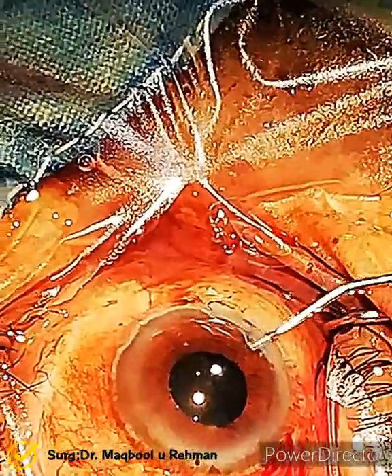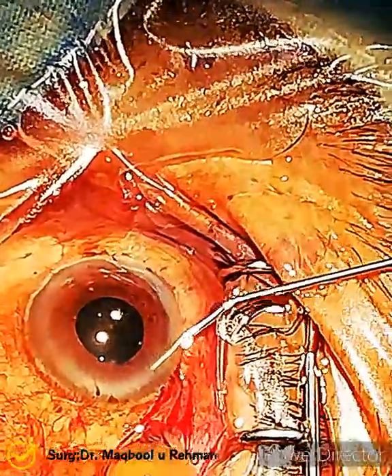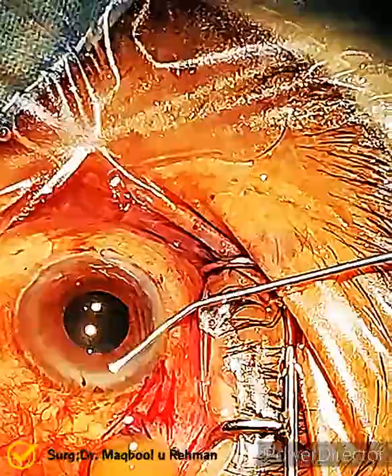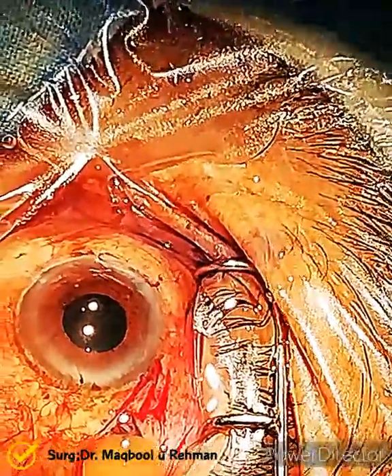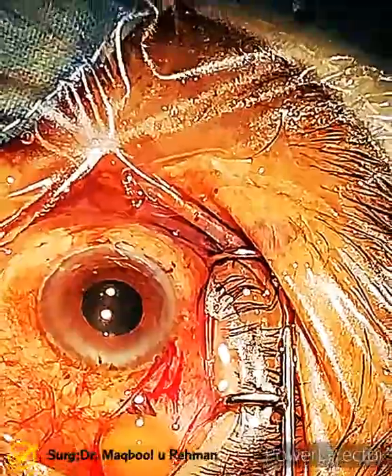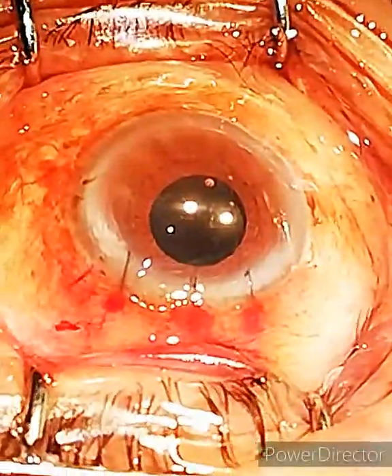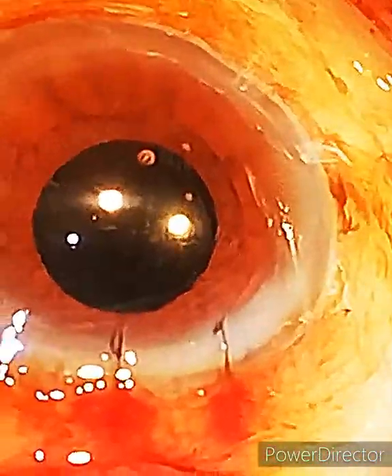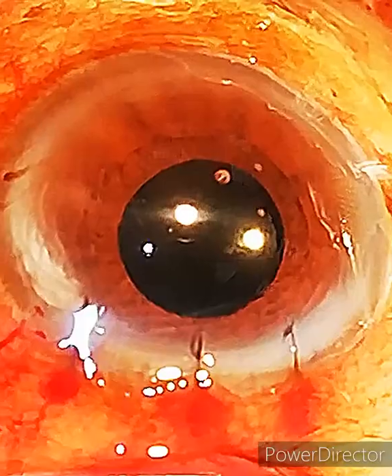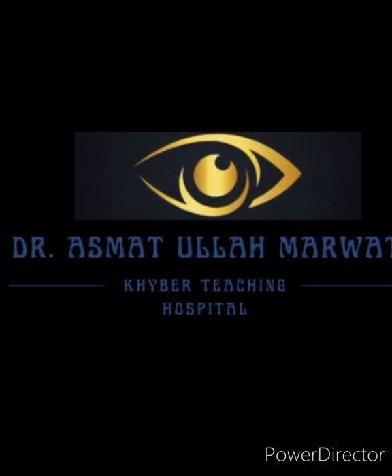The quality of the video was not very nice, so I increased the contrast and brightness so the view is clear. Three sutures were placed by a junior surgeon, and the case was done very nicely. Hope he will have a good life. Thank you.